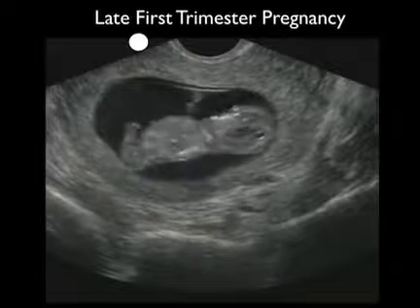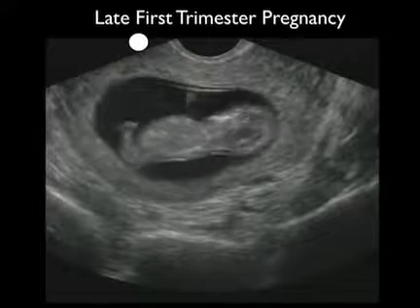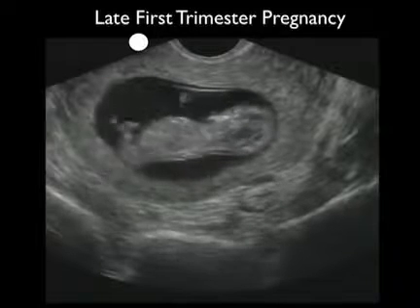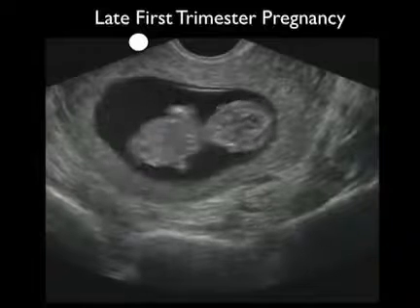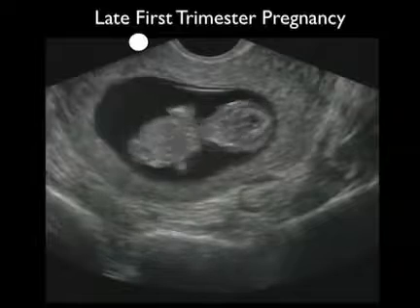Here's a transvaginal sonogram of a late first trimester pregnancy. And as I work in northern Manhattan, we refer to this as the merengue baby. And note the arms and legs moving fluidly to the merengue music, a sure sign that this kid will be a slick dancer.